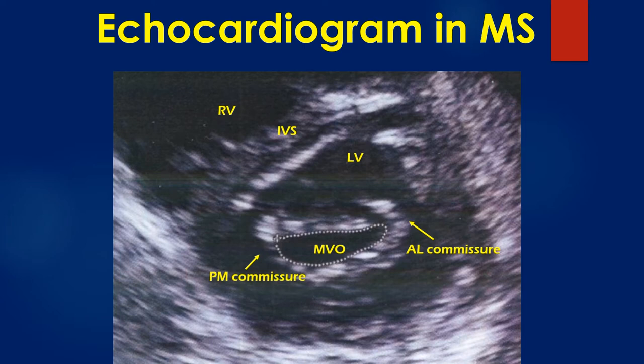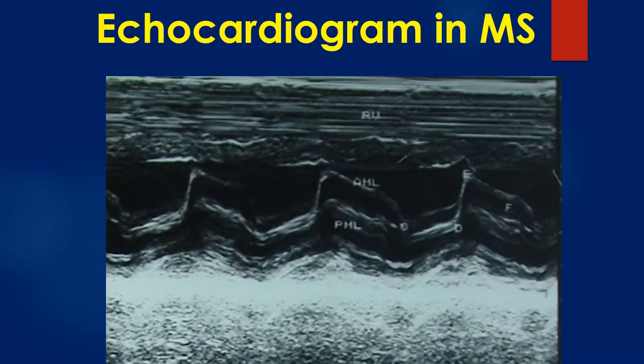Ideally, the smallest full circle should be taken to planimeter the valve area. If it is not a full circle, the subvalvar pathology may be measured as the valve orifice. If the smallest full circle is not taken, it will be the valve proximal to the severest stenosis, that is the valve belly. M-mode echocardiogram showing the paradoxical anterior motion of the posterior mitral leaflet in diastole with reduced separation of the leaflets.